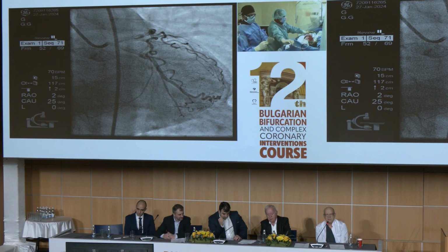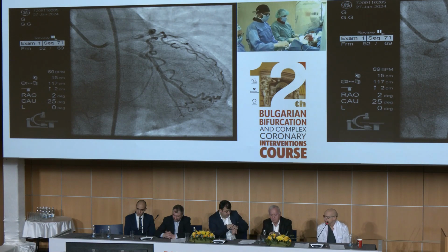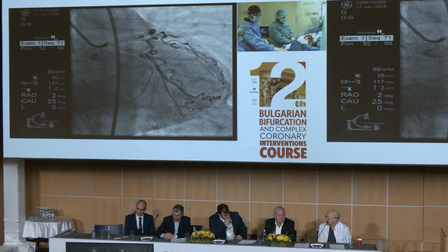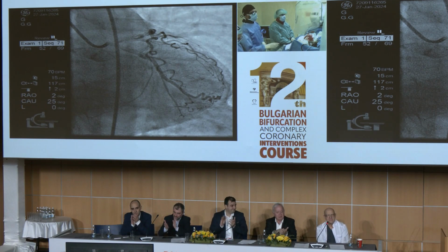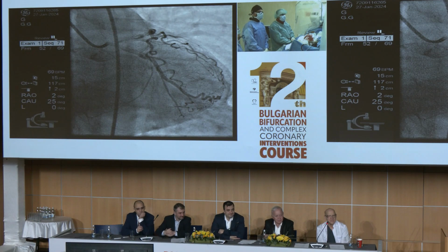5.5 square millimeters in all stents. Otherwise, we were going to work with 2.75 stent only, in all vessels, which is not possible. So, congratulations. Okay, thank you. Really very didactic and very systematic work with an excellent result. Thank you.